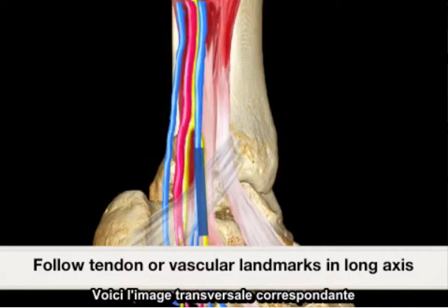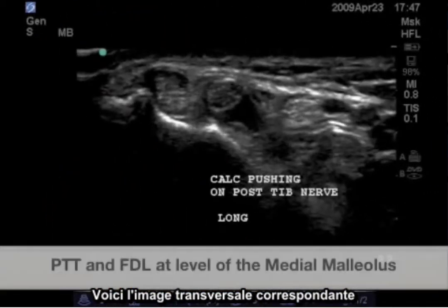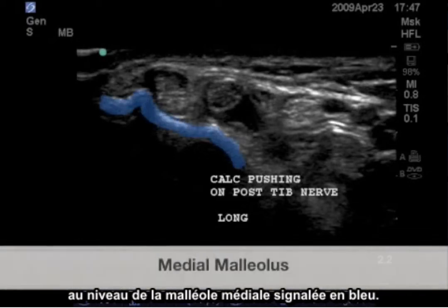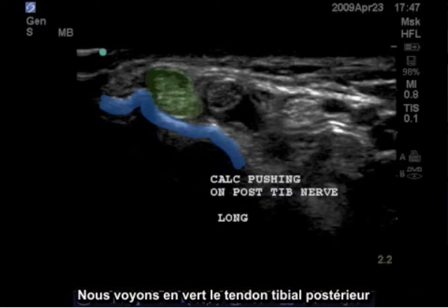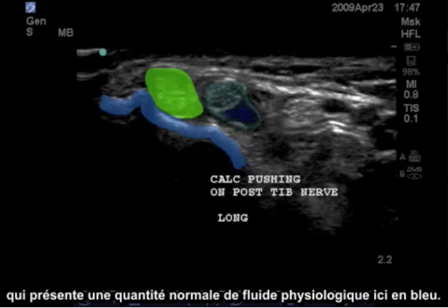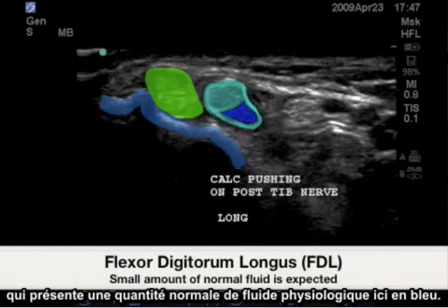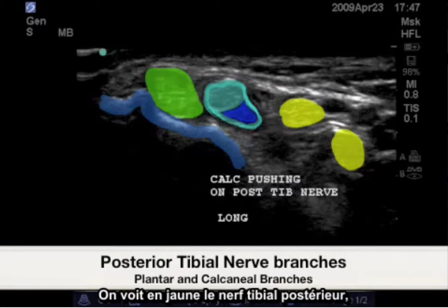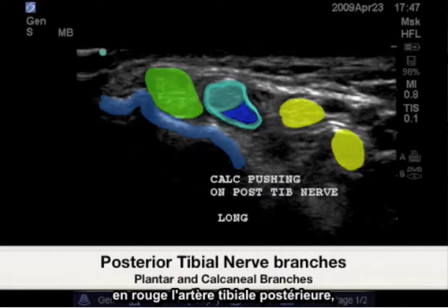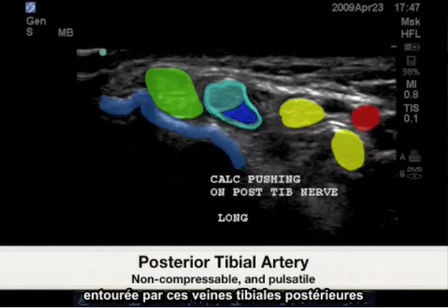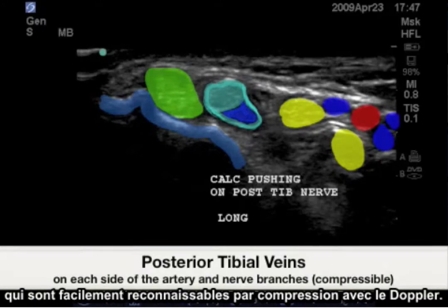Here is a corresponding transverse image at the level of the medial malleolus, highlighted in blue. We see the posterior tibial tendon highlighted in green, followed by the flexor digitorum longus with a normal physiologic amount of fluid in blue. Highlighted in yellow is the posterior tibial nerve, and in red the posterior tibial artery, surrounded by posterior tibial veins which are easily identifiable by compression and utilization of Doppler.